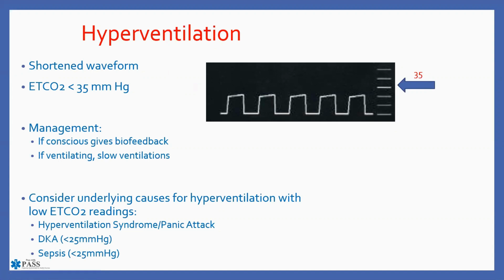And this is a very difficult thing to do. But if you're getting this hyperventilation or shortened waveform at 15 on a patient that you are ventilating, and let's say you're ventilating them at 18 times a minute, you may have to drop down and ventilate them at 8. So the evidence is there. There are people that will back you. Your medical director should back you.